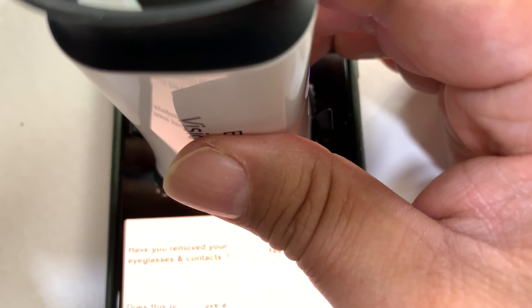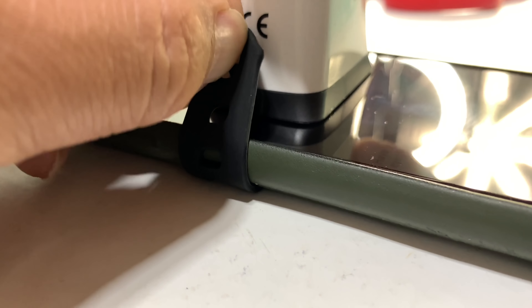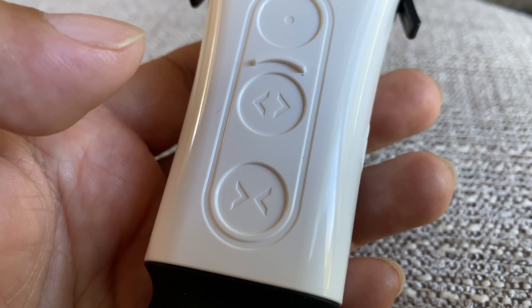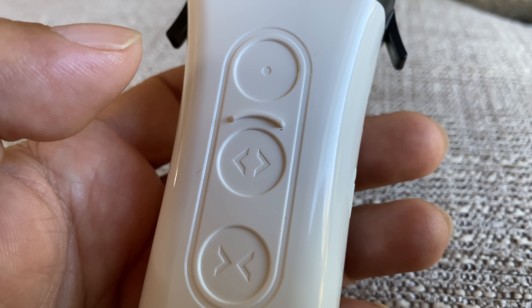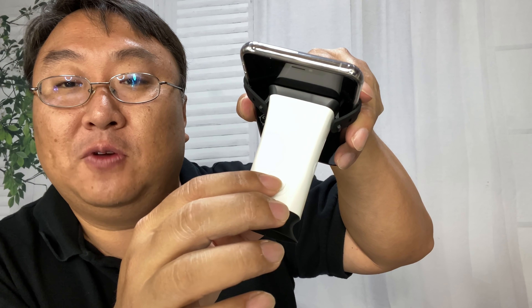Next, take this little rubber strap and hook it onto these little protrusions on the side so that it stays in place on your phone. On the top of this device — it may not be super easy to see — there are two controls. These are capacitive buttons, so they don't actually depress; you just kind of tap them and you will hear and feel the device working.